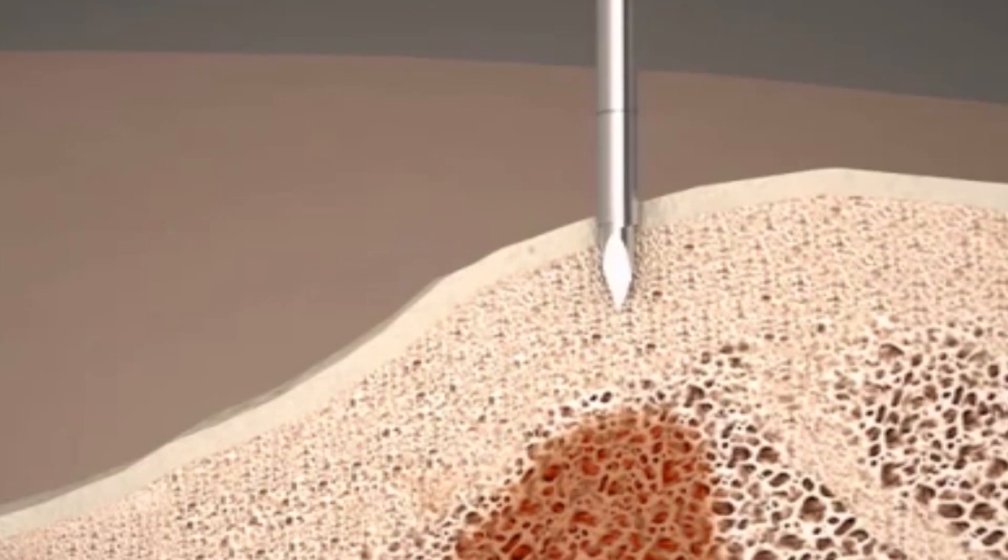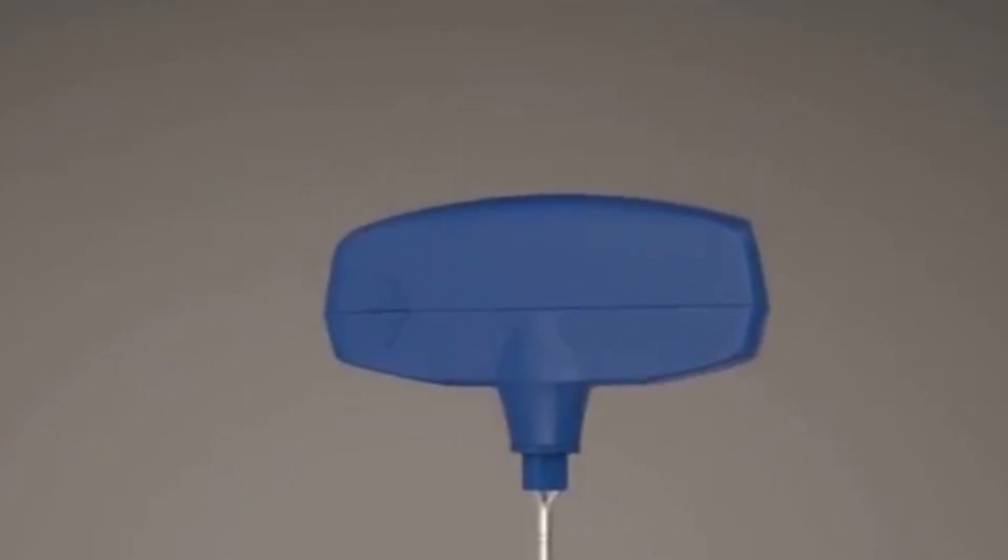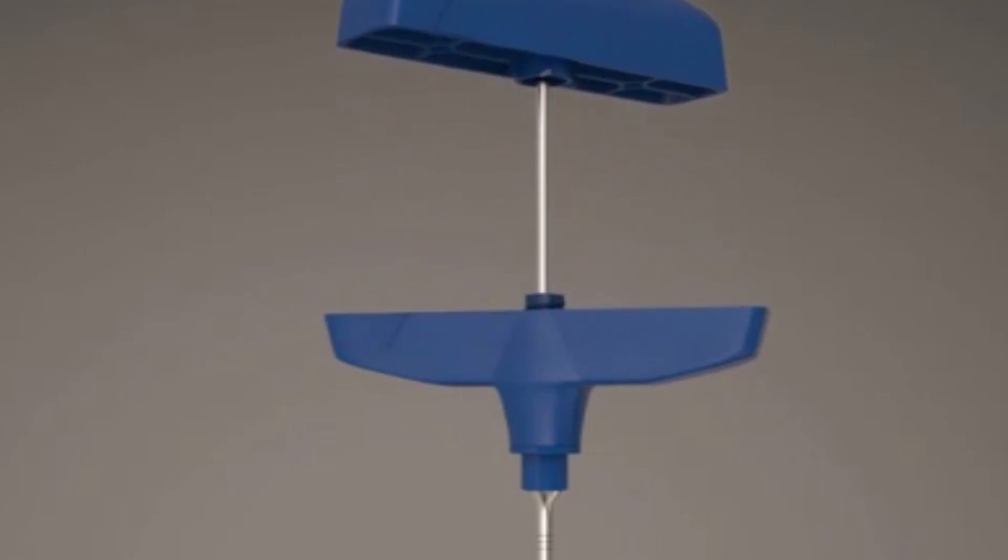Here, if desired, the trocar tip stylet may be exchanged for the drill without losing your place in the bone. To switch to the drill, the handle of the introducer is unlocked by holding the base half, unsnapping the top segment, and withdrawing the trocar tip stylet.